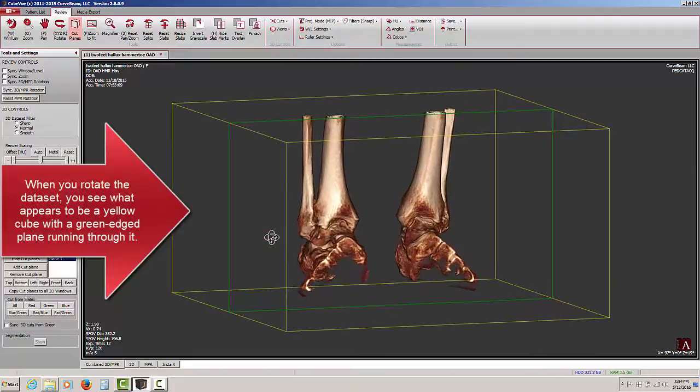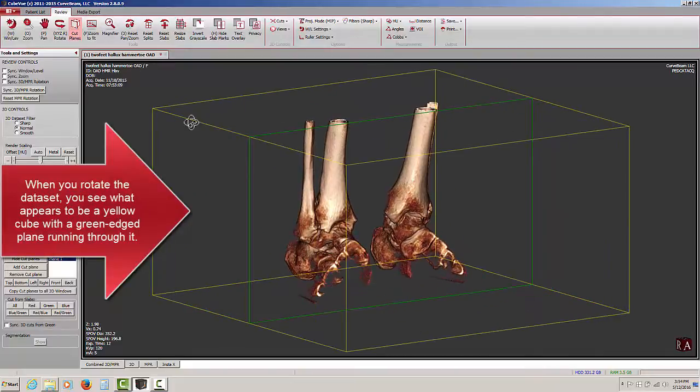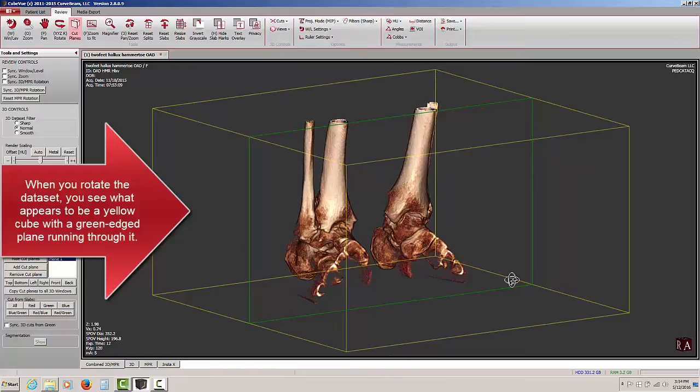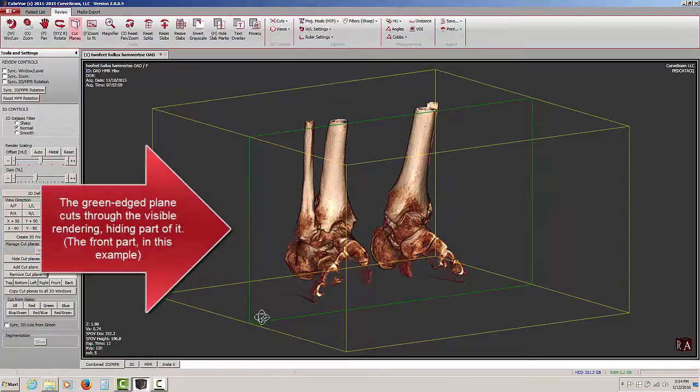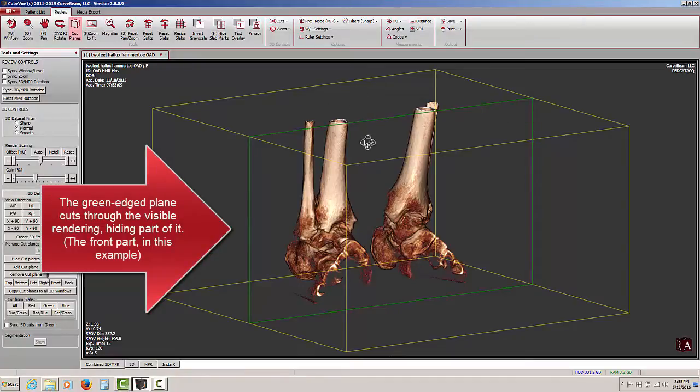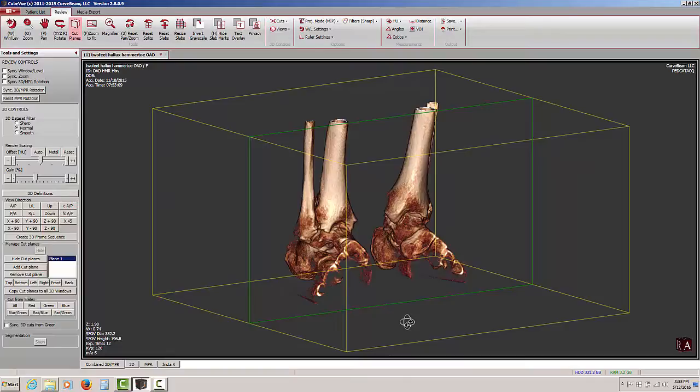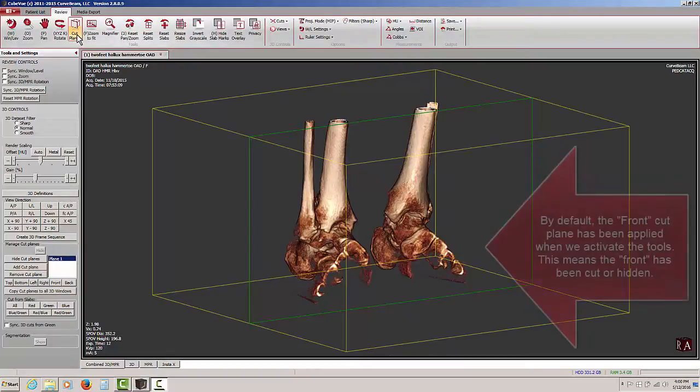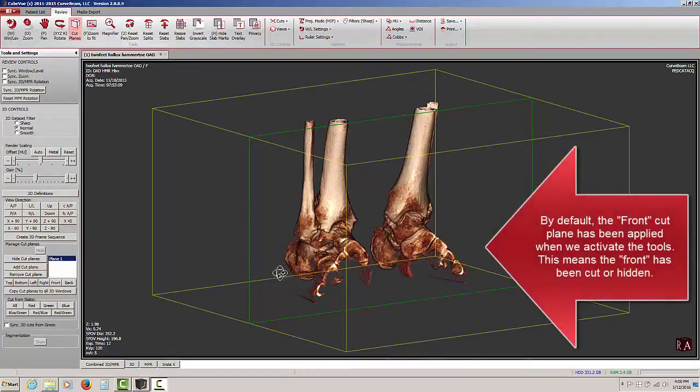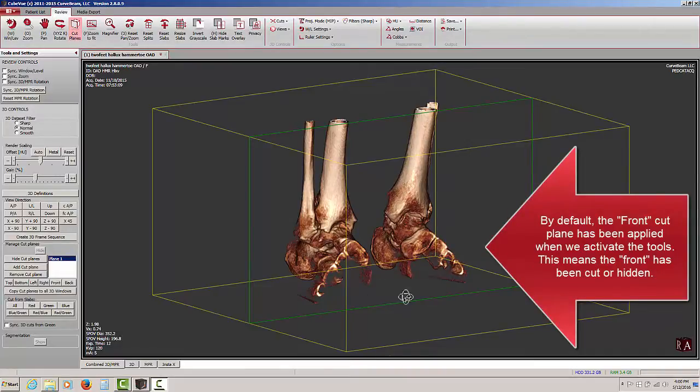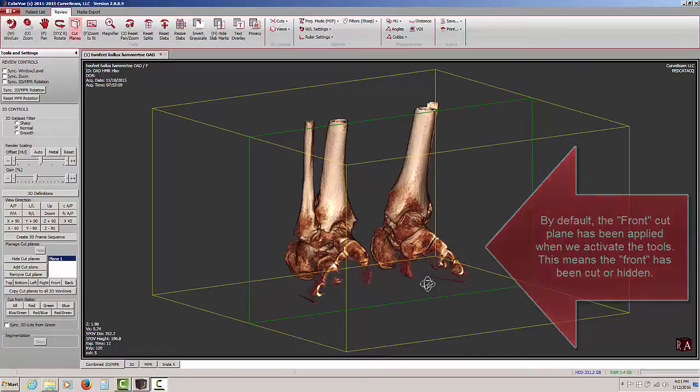By rotating it, this cube or cubic shape represents the patient data set, and we can see a plane outline by this green line that is passing through the middle of it, front to back. Whatever is in front of that plane has been removed from view, and whatever is behind that plane is visible. By default, when we click on the cut planes button and activate the cut planes, it appears as though the front half of the data set, meaning the metatarsals and the toes in this case, have disappeared from view.